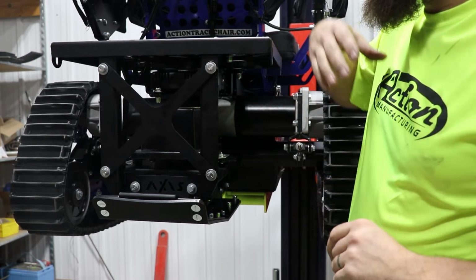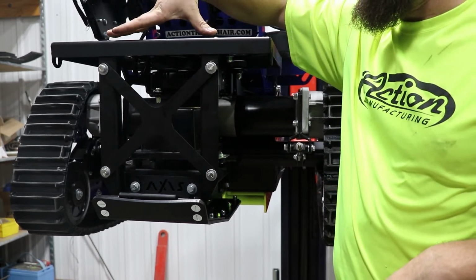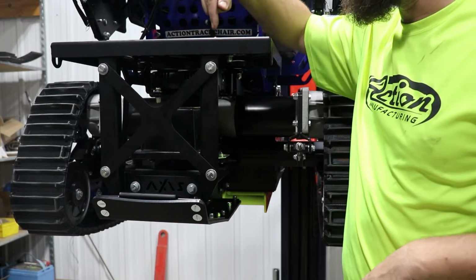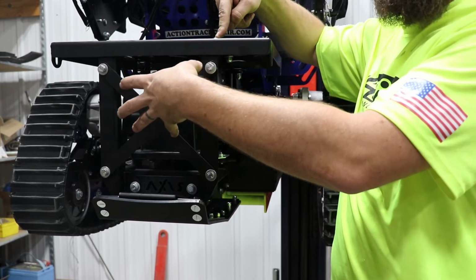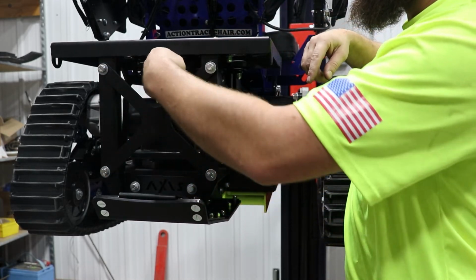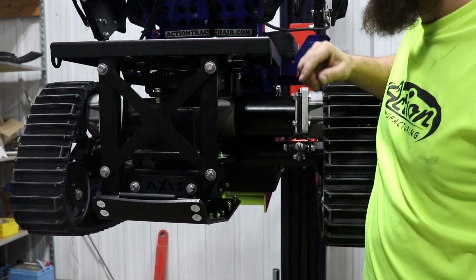Once you get all the hardware started, tighten these first because they have square holes that line up through each part. Get those tight and then go through and retighten everything that's holding everything else on in the hex head bolts.